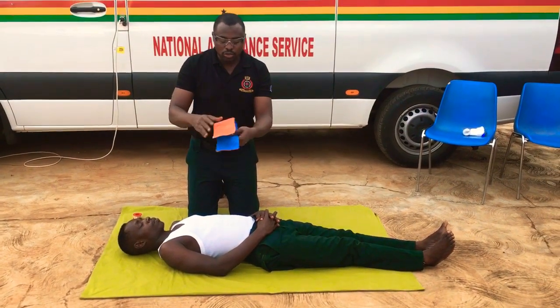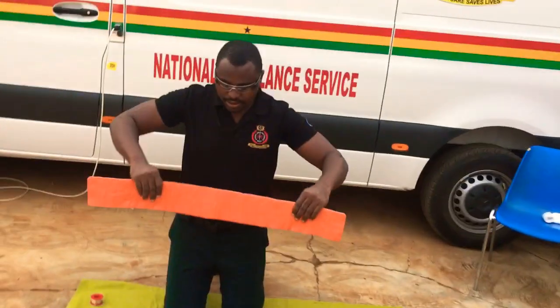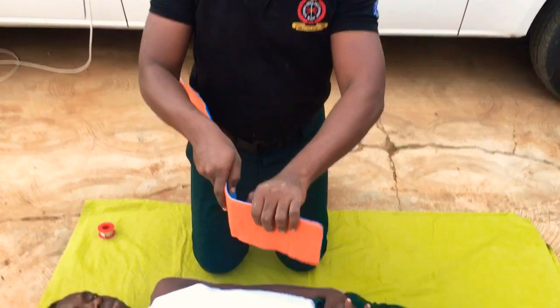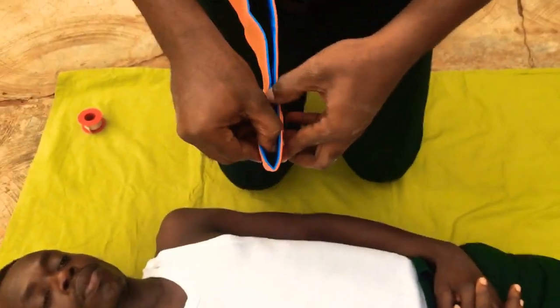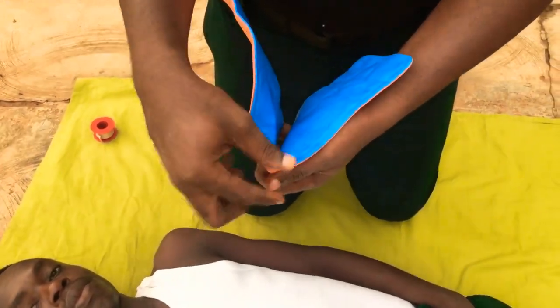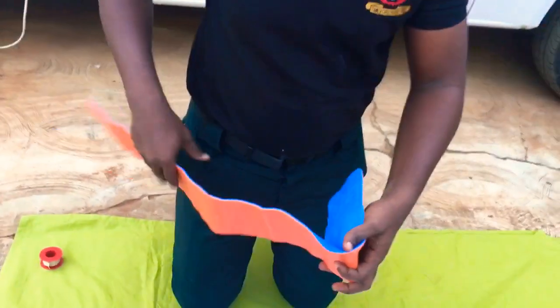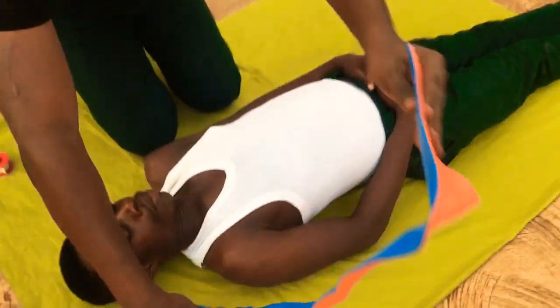First, take the splint and make sure you straighten it, then curve one side. After curving, turn it so that the chin rest area is correctly positioned — this is where the chin will be resting. Turn it into the correct orientation before approaching your victim.